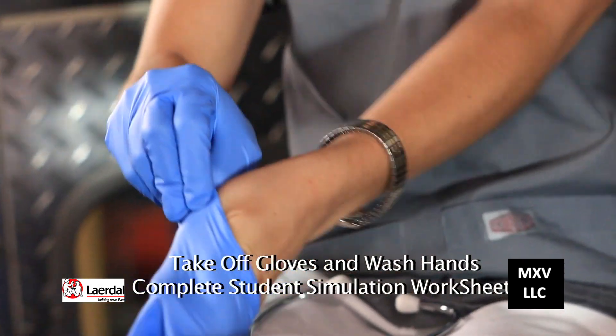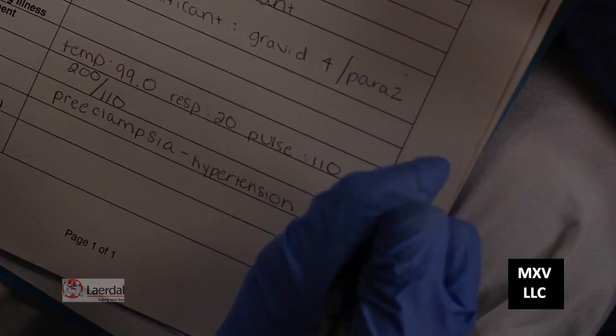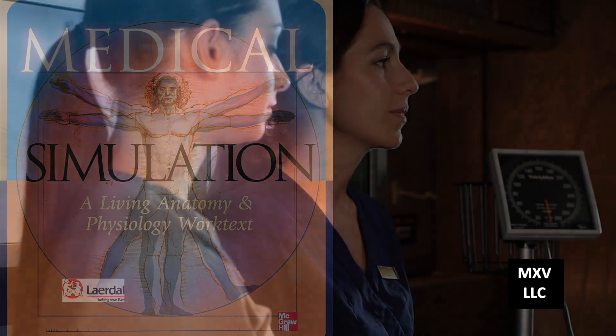Then take off your gloves and wash your hands with the alcohol sanitizer. The last thing you need to do is complete your student simulation worksheet. Okay Holly, are you ready to demonstrate how to take a blood pressure?